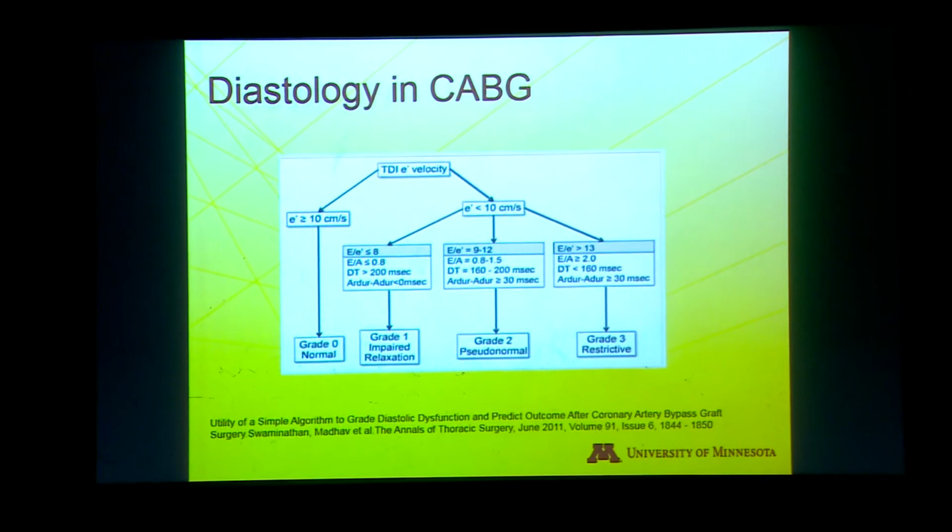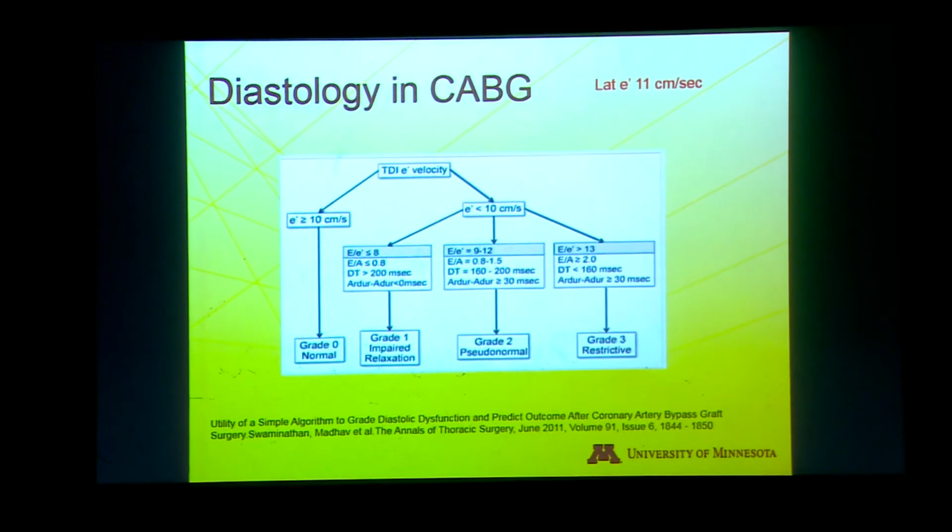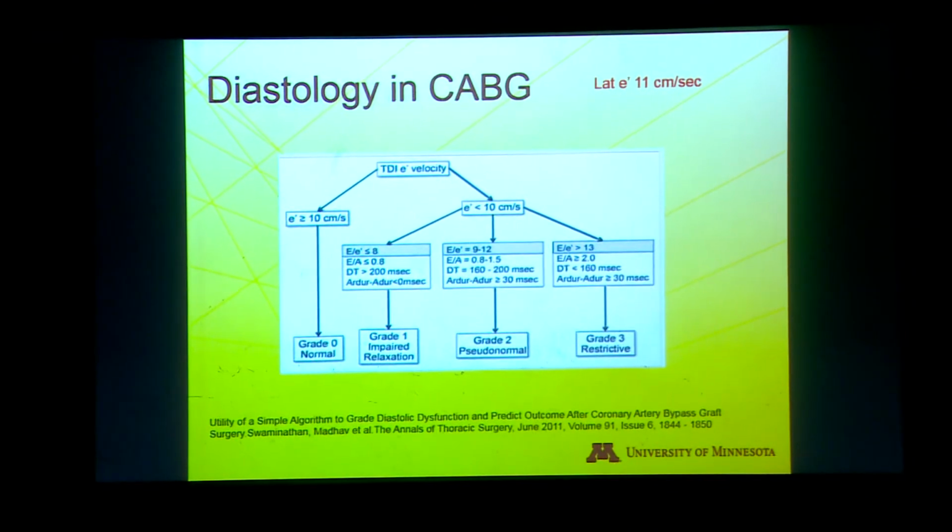So what they found is that the cardiac anesthesiologist's ability to look at diastolic dysfunction using a simplified algorithm meant they could diagnose more patients. And coming back to our patient, the lateral E prime was 11 centimeters per second there.